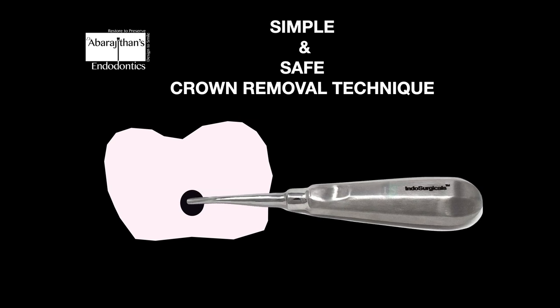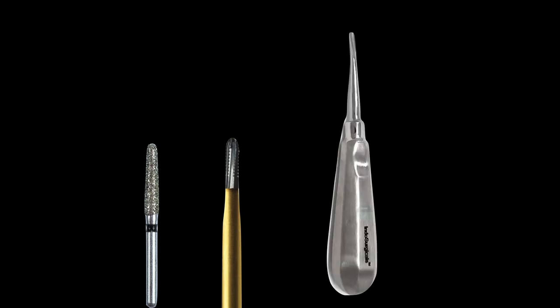Before I demonstrate this technique — to make a keyhole, if it's a ceramic crown you can use a coarse diamond, and if there is a metal part, it can be cut with any metal cutting burr. Following which, you can use a coupland elevator with a small narrow tip compared to a broad one.